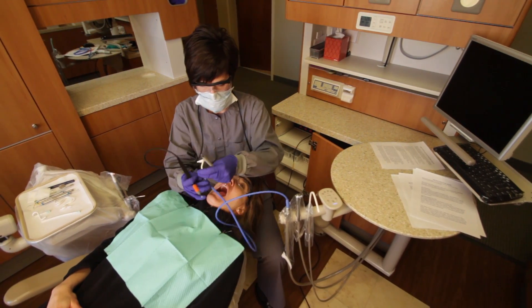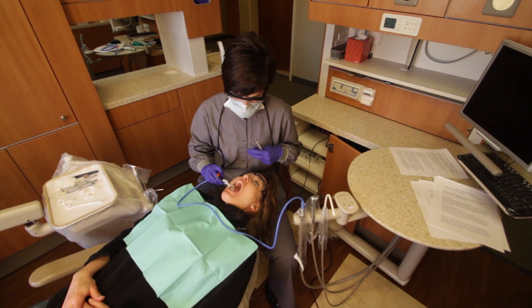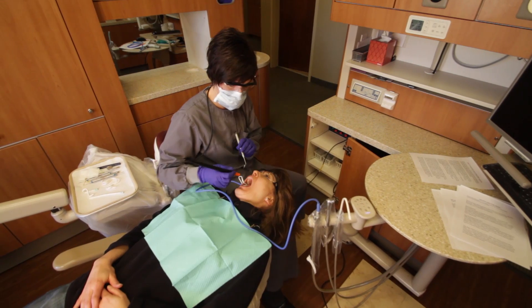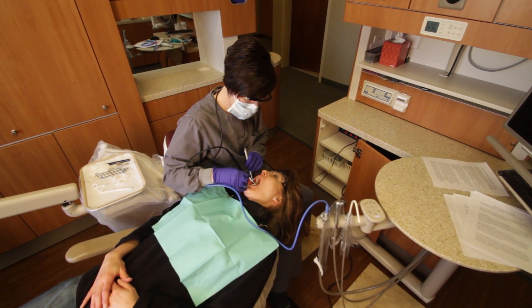Once finished with the left side, move the saliva ejector to the right side of the patient's mouth. The BlueBoa is 42 to 48 inches long and will easily access both sides of the mouth. There's no need to re-bend the saliva ejector.